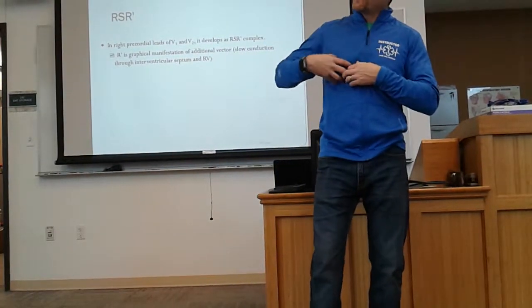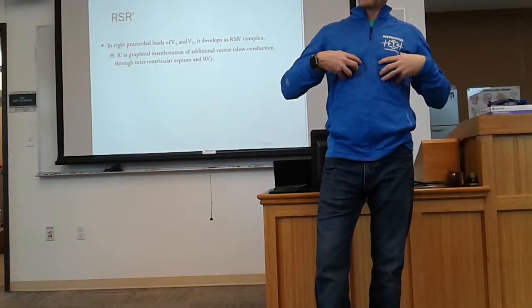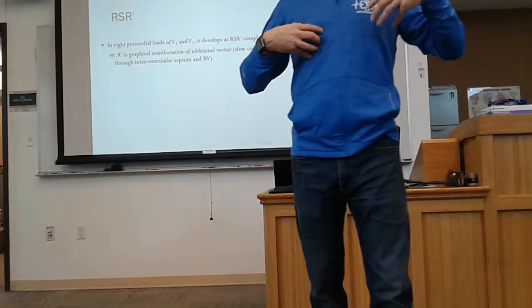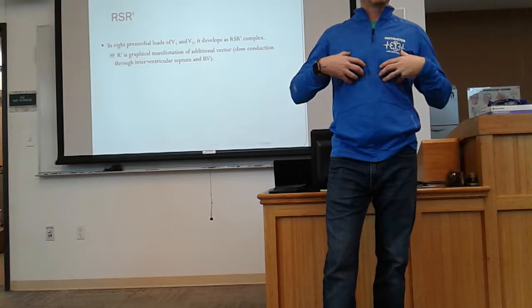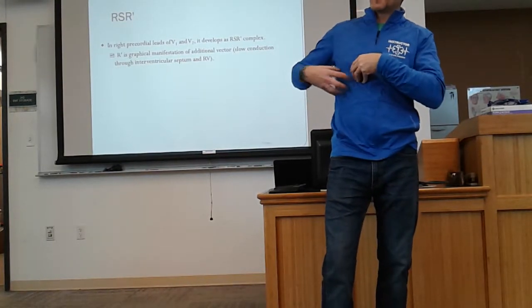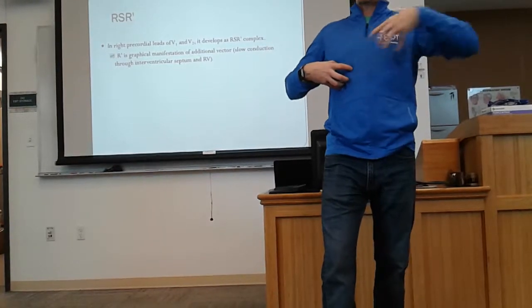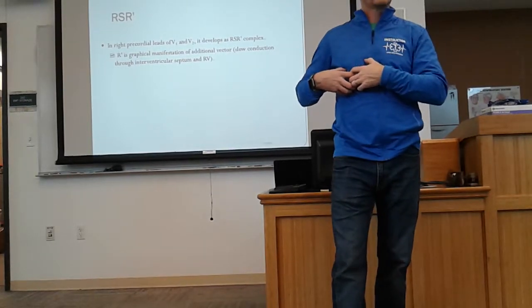The right side didn't fire when it normally does for V1. The left side fired on time, and the right side was being delayed a little bit, right? So we see a QRS complex from the left side in V1, but once that's done, very, very clearly, we see that right-sided QRS next. It's not hidden by the left-sided stuff because V1 is not behind the left ventricle, it's right on top of the right ventricle. So it sees the right-sided QRS very easily.